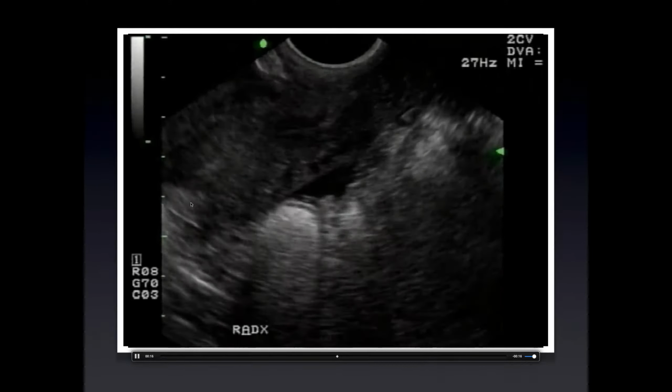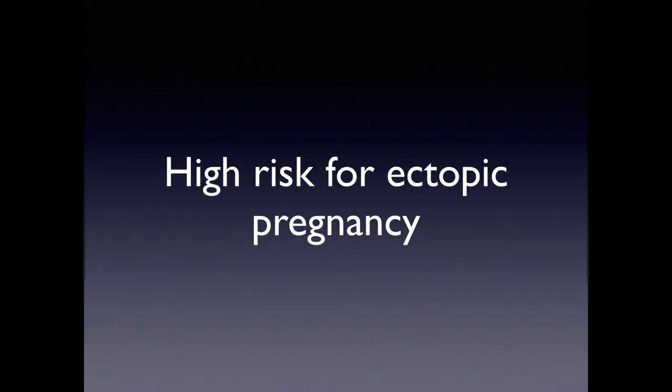So our diagnosis is once again no definitive intrauterine pregnancy. However, at very, very high risk for ectopic pregnancy, the large free fluid alone gives it an 86% chance of ectopic pregnancy, and when you add the mass to it, that takes it up to 97%. So this patient went to the operating room and had an ectopic pregnancy diagnosed.